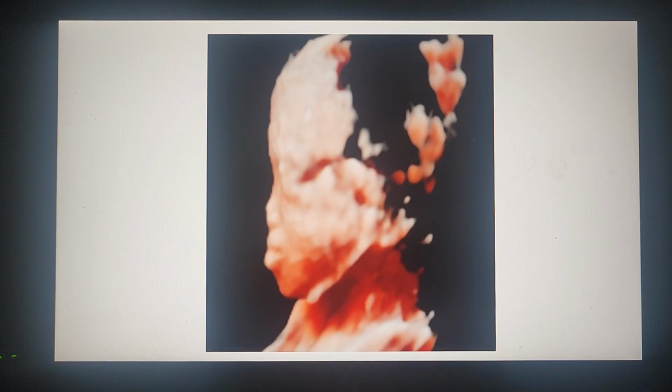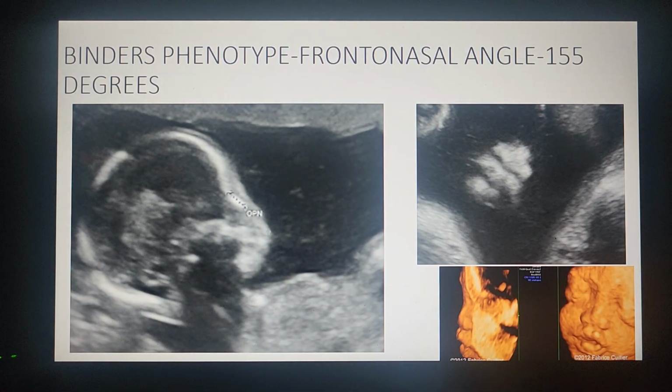Now we do a 3D to get a good assessment of this face, and you can see that in the 3D the profile view shows a complete absence of the normal projection of the nasal bone outside, a depressed nasal bridge, and a flat face, and this is a 3D of a binder's face.